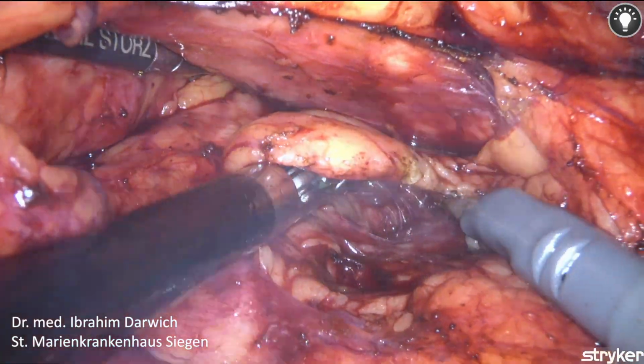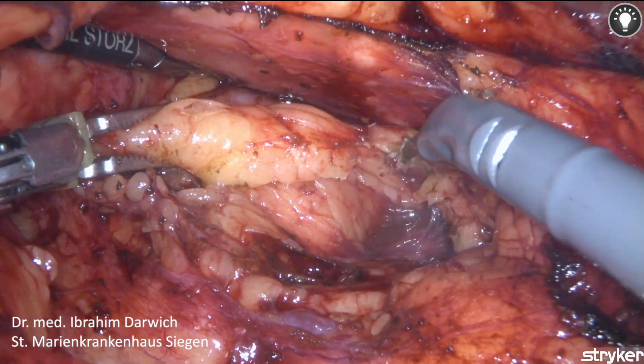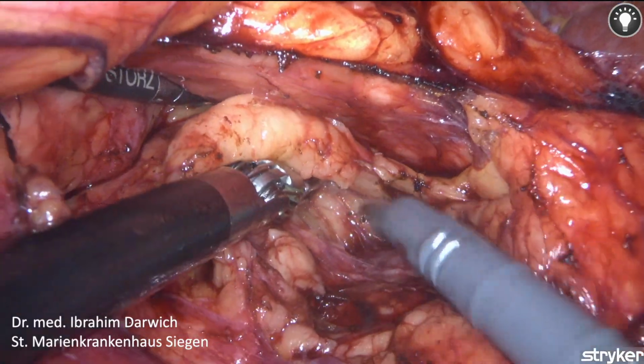The surface of the kidney is now visible, and dissection continues along the avascular plane until the first small veins and arteries are encountered, mainly on the medial aspect.